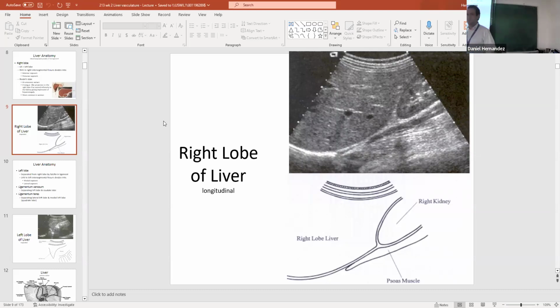So someone in the echo department was scanning hearts, and then we come subcostal through the liver to image the heart. And they were supposedly seeing all these liver lesions. I never know if there's anything wrong with the liver. It was someone overreading an echo. I just look at my IVC coming through there and hope that there's nothing huge on the screen.